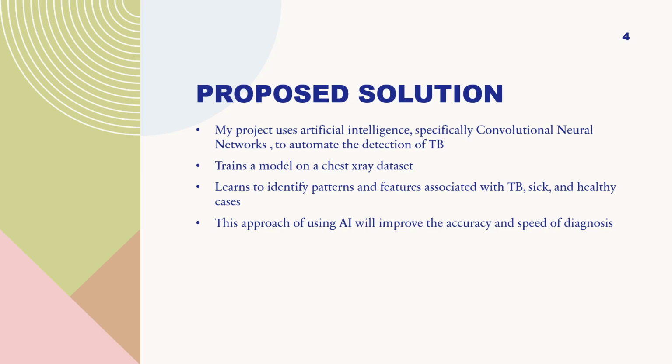So my proposed solution is to make a project that addresses this problem by leveraging AI, particularly CNNs, convolutional neural networks, to automate TB detection. So the goal is to train a model to detect TB using chest X-rays and using a chest X-ray dataset.